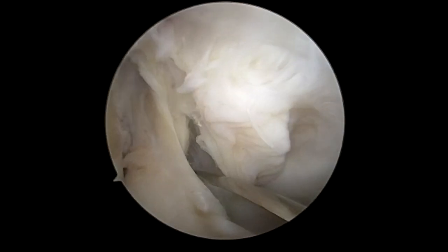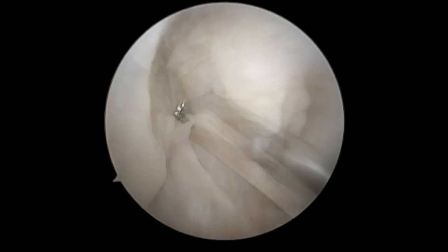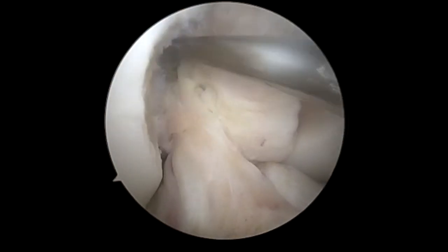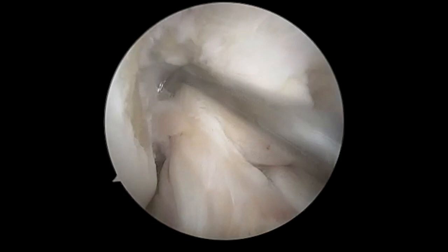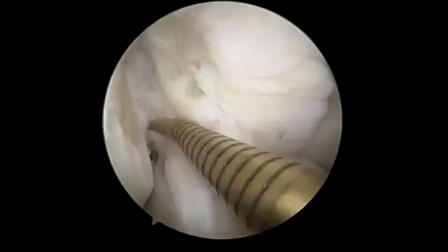Then we're going to use a freer. This is a lot less sharp and less likely to cause damage, to elevate the ACL off the PCL. Then here we're going to do a little more debridement of that stump to allow for healing potential.